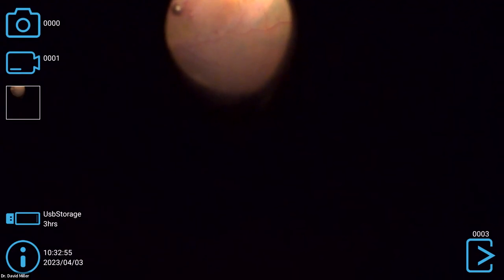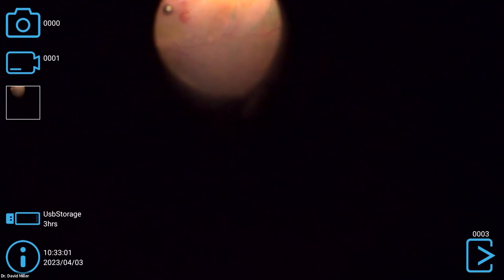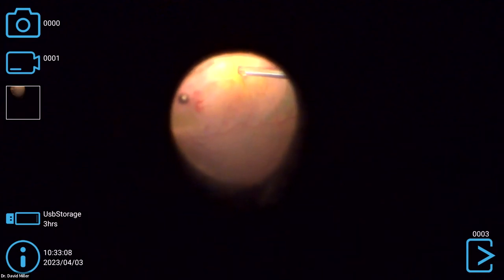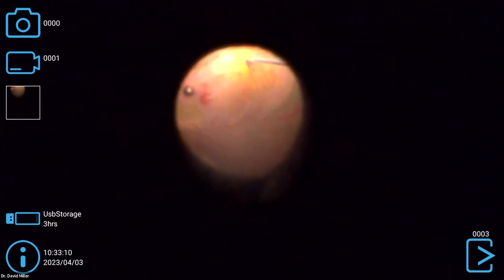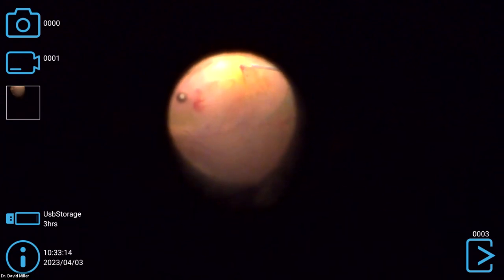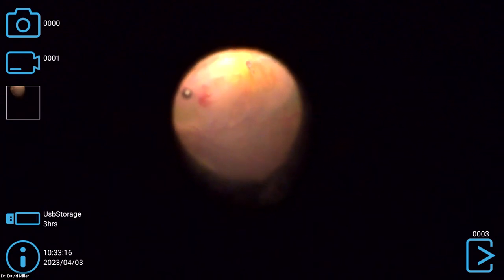Now, this is very gentle aspiration. Oh, thank you. Yep, let me know every time. So there's no hole down here. It's just a hemorrhage spot where the ERM was very thick. It was its epicenter, more or less, right?